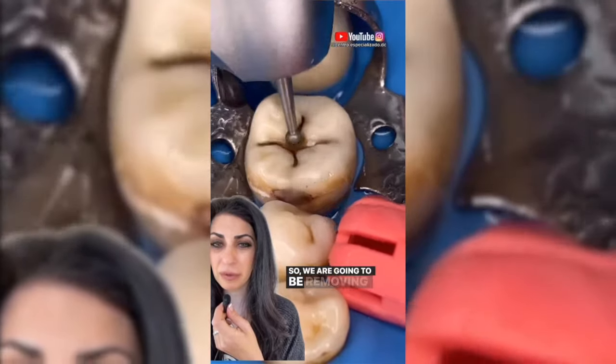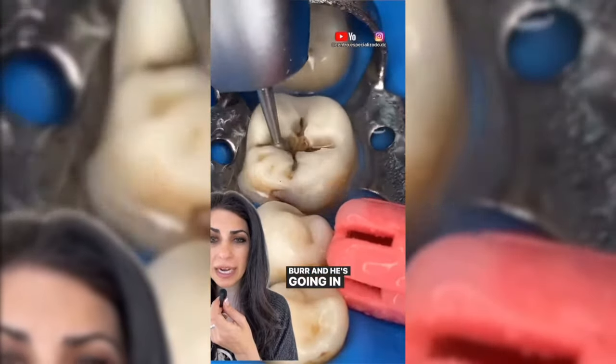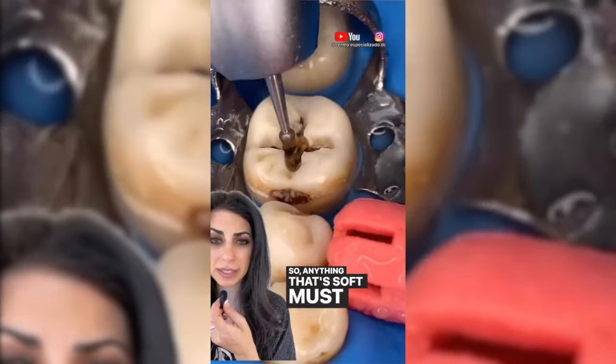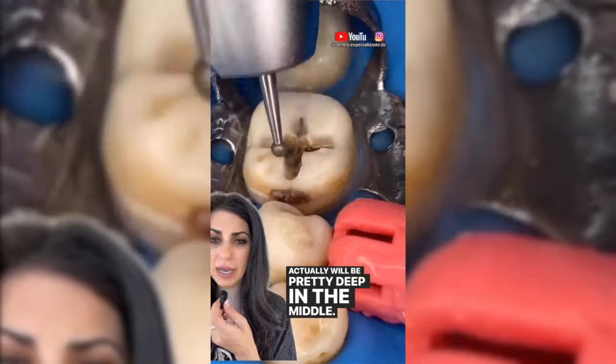We are going to be removing a cavity here. The doctor is using a high-speed handpiece with a round burr, going in and removing all the tooth structure that's decayed — anything that's soft must go. This one looks like it will actually be pretty deep in the middle.